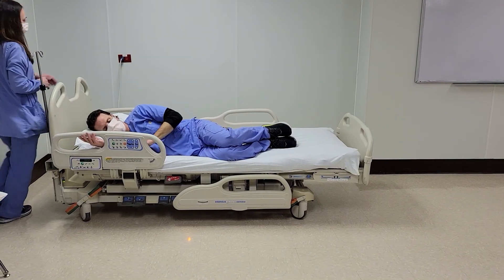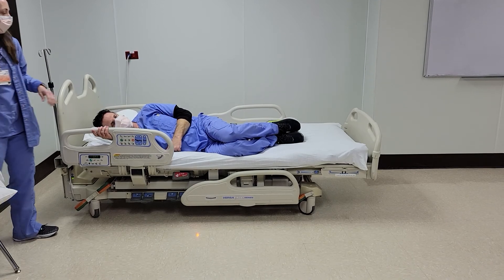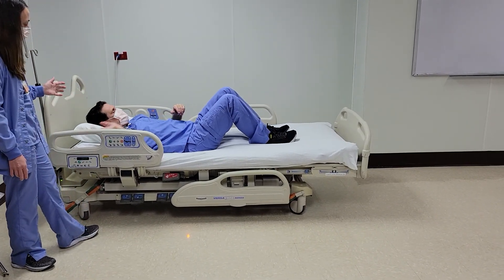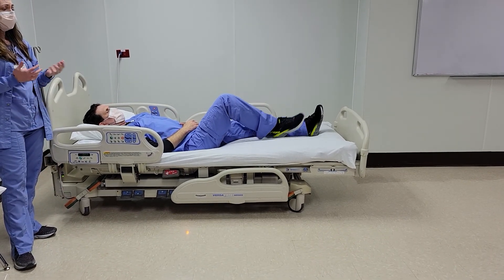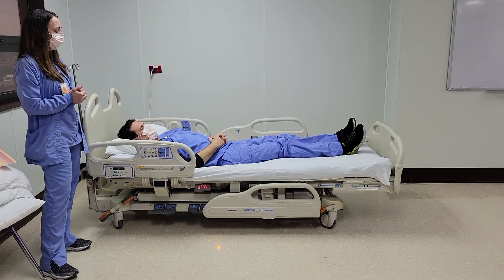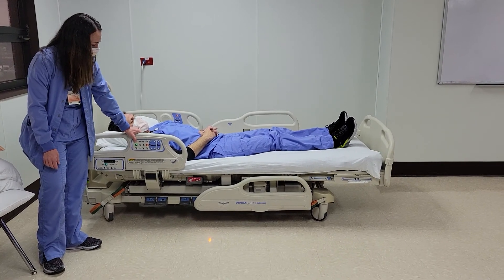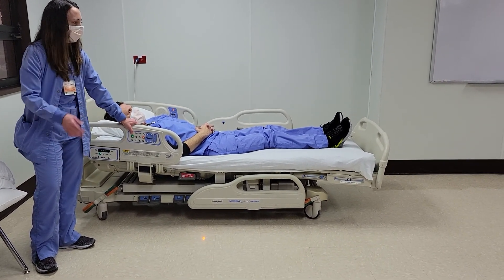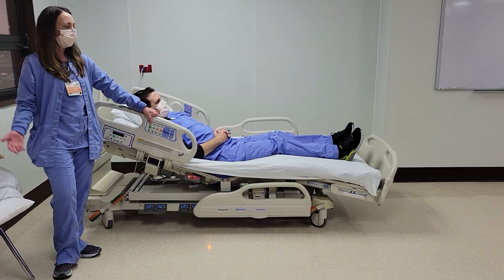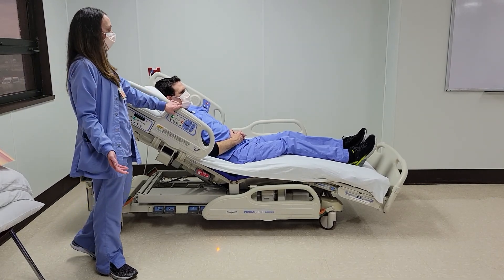There's also an easy button on the bed called the cardiac chair position. We're going to have the patient roll to the side — knees bent. This is an easy push of the button. We recommend your patient being in this position as much as possible, especially for any feeding positions. You hit the key button and right above it is the cardiac chair position — we're going to let the bed do the work. Keep in mind your patients who are on aspiration precautions should not be lying flat.